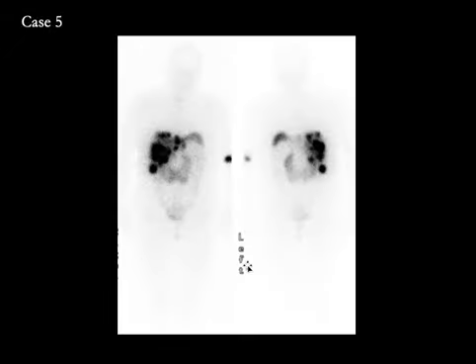Here is a patient with history of carcinoid tumor which has metastasized to the liver. In the anterior and posterior whole body images, we see multiple intense foci of uptake throughout both lobes of the liver, consistent with bilobar hepatic metastases. Site of injection is seen here in the left antecubital fossa. Incidentally seen finding is a horseshoe-shaped kidney.